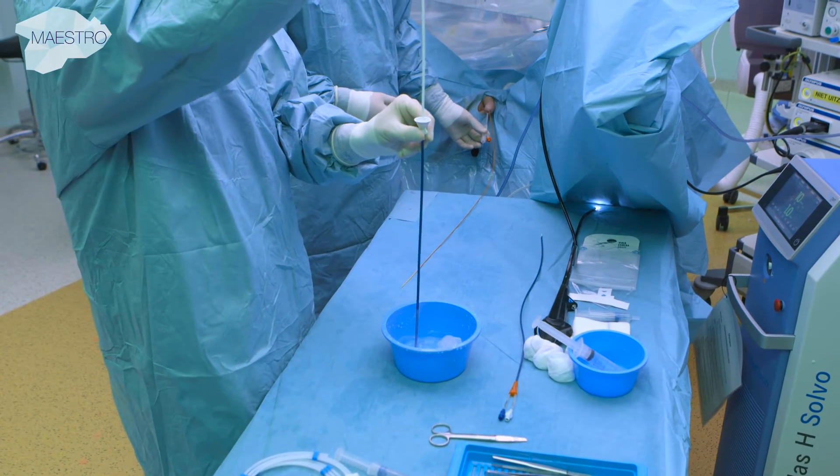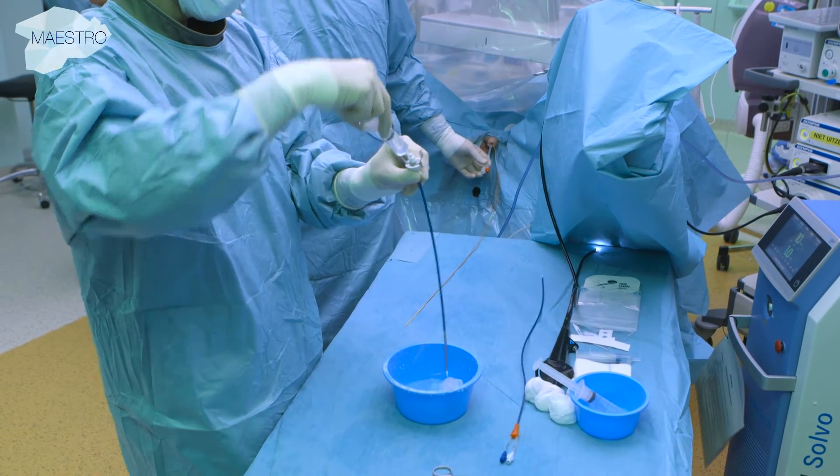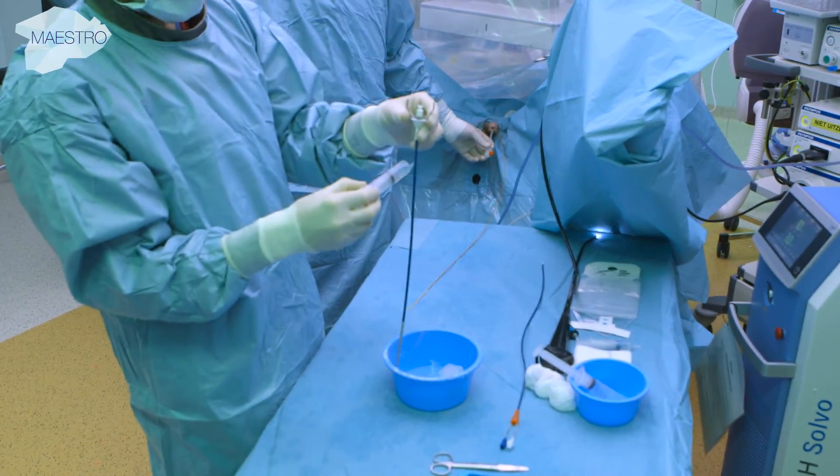The small size of the 10-12 French access sheath in combination with the latest endoscope generations ensures adaptation to the patient's anatomy to reduce the risk of lesions in the ureter.